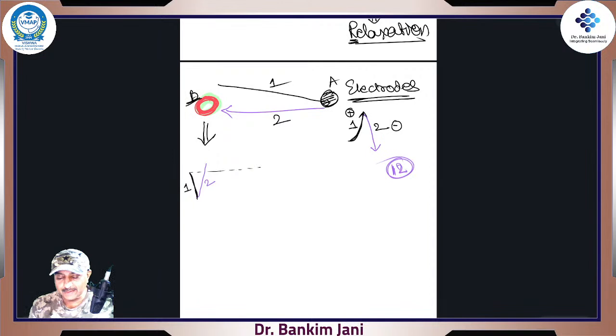So it is with respect to that particular electrode. This is the basic electronics, right? Regarding the depolarization wave, if the contraction is occurring over here, then we call this depolarization, and when it is going down, it is repolarization. But it could be the other way around also, right? So that's why, from the electrode, this is the basic principle of electrodes, right?